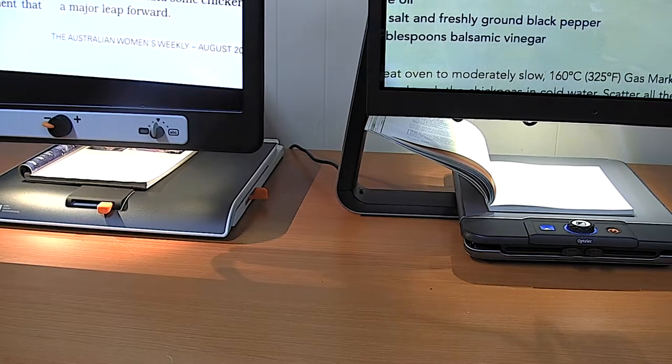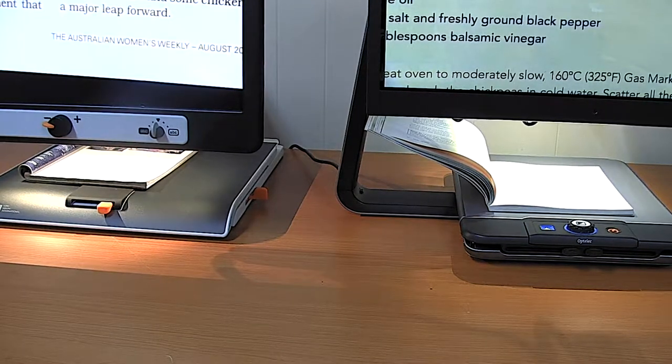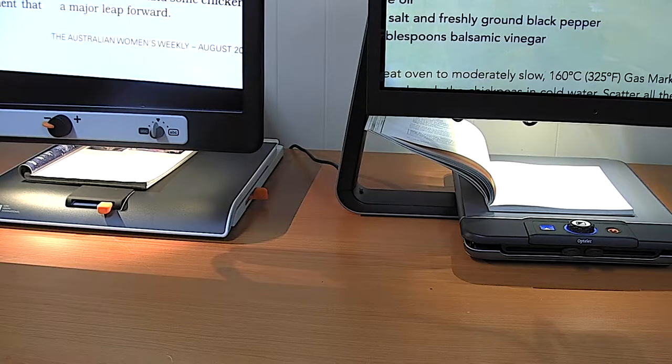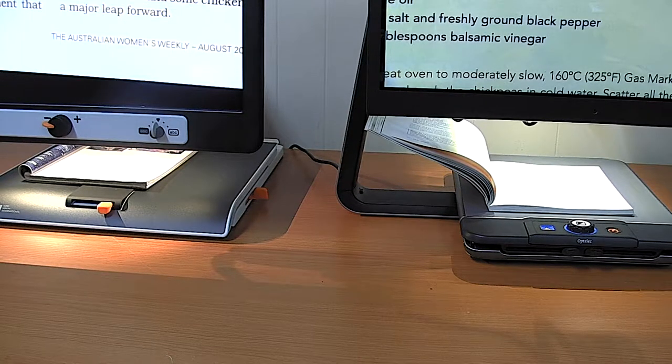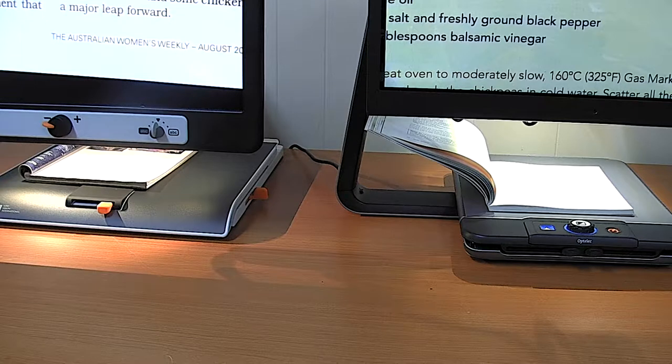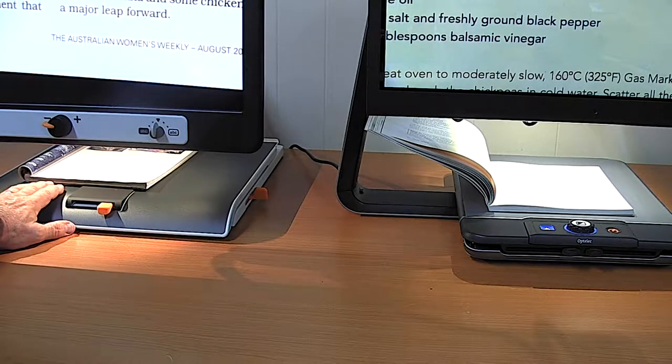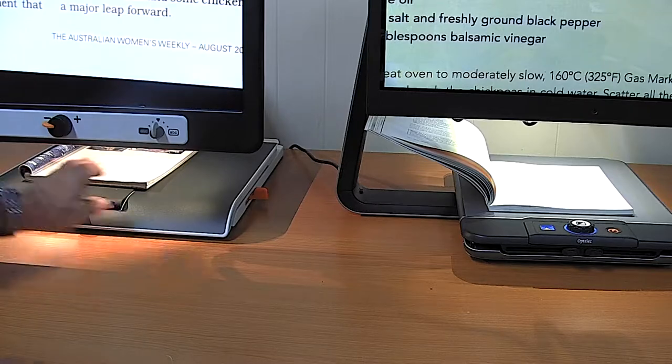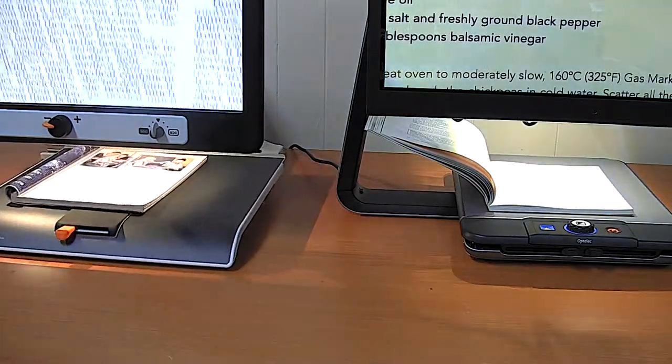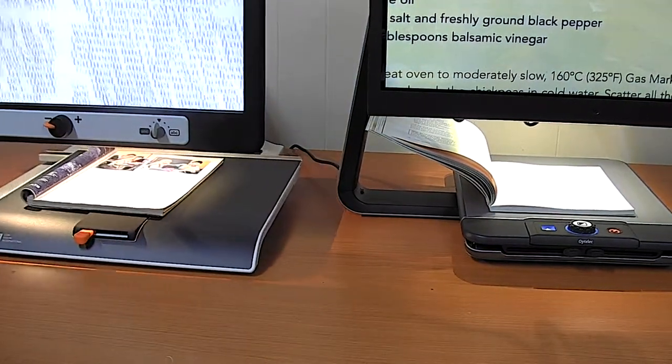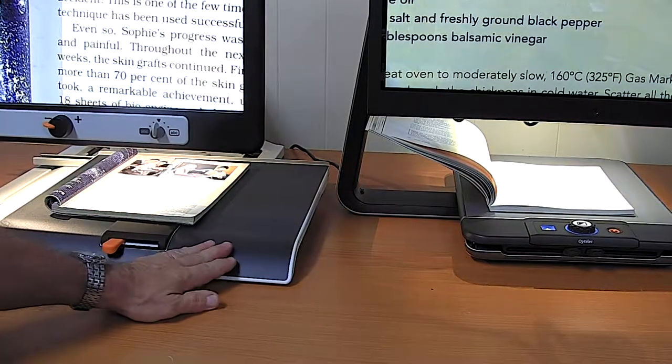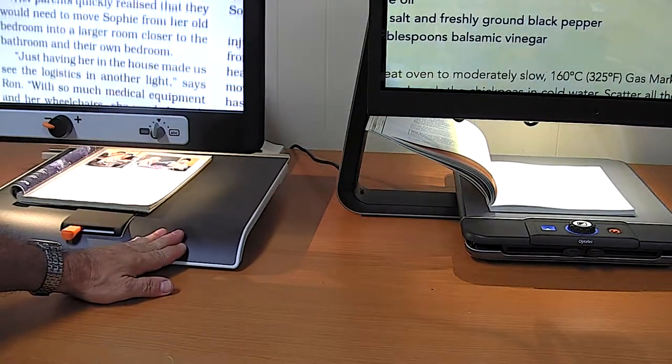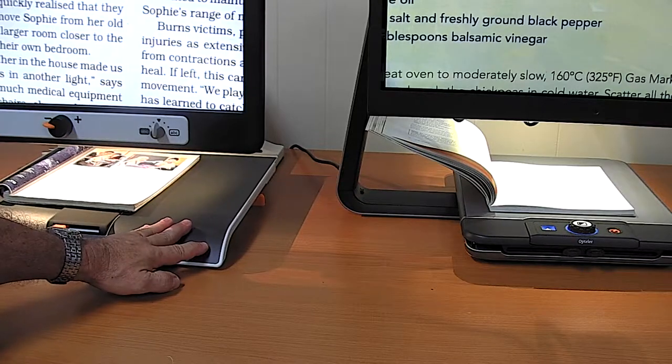In this section we're going to look at some of the reading trays that are available for desktop electronic magnifiers. The reading tray is a convenience function for placing books and documents underneath the camera with the ability to slide them in a very smooth way backwards and forwards and left and right.